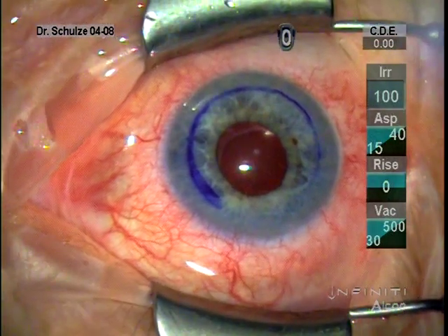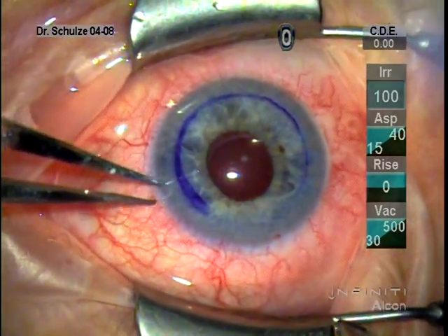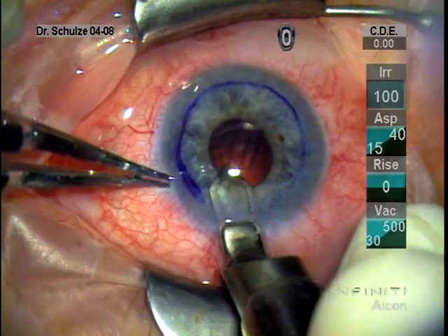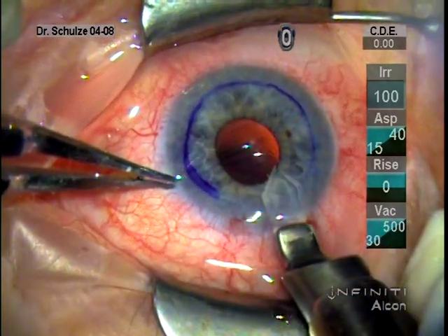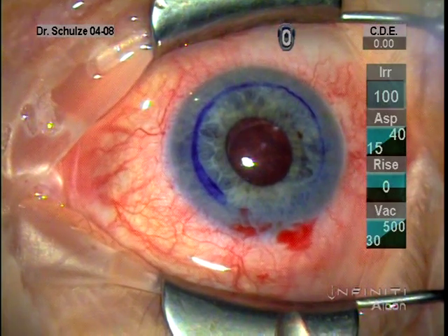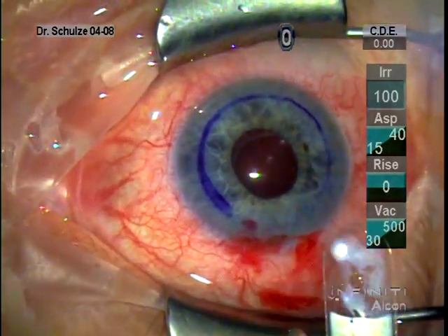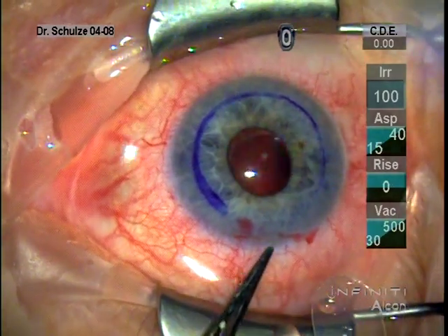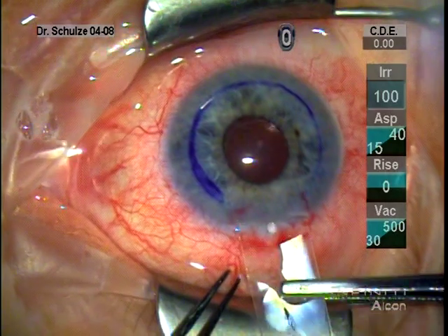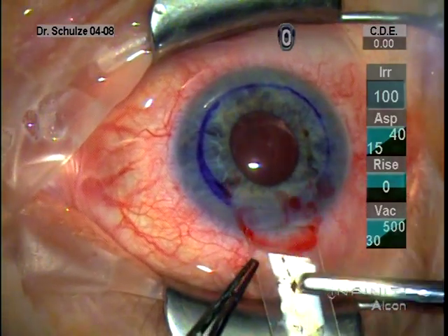Having removed Descemet's, I just use the irrigation-aspiration device to remove the remaining viscoelastic and enlarge the wound to about five millimeters with the diamond keratome. Having enlarged the wound, in this case I'm using a sheets glide to place through the wound and into the anterior chamber. A number of folks have suggested that the sheets glide may not be necessary and that you can do this technique without a glide. I may give that a try in the future, but most recently I've been using the glide.